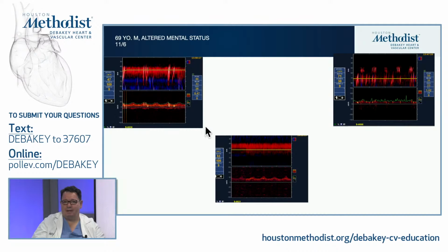So this is the power of TCD, that you really can follow, and you can see what you did. You definitely get rid of all those source clots that were generated. But again, because the LVAD is also metal, that metal can also generate some cavitation, some artifact.